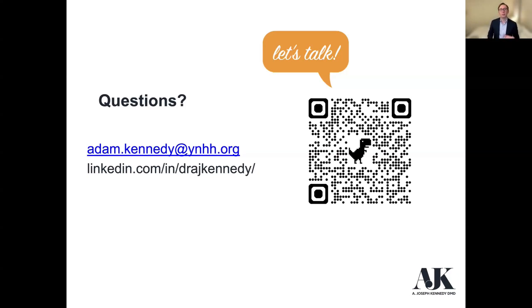But we know we can replace these pretty quickly if we've done a digital design. So let's say a resin printed denture only lasts 2 or 3, maybe 4 years. Well, maybe you have it worked out where your fee is a little bit different, where we can just print another one for that patient at a reduced cost and get them moving again. Or conversely, you can just send it to a milling unit or have your lab like NDX go ahead and mill it for you in a pre-polymerized PMMA block. So I don't have that answer right now, unfortunately. It's showing promise that it lasts pretty well and pretty long, but I'd love to see some of the data before I speak confidently on that.